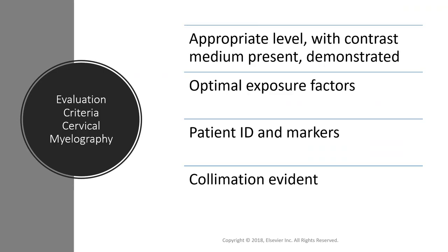Evaluation criteria for the cervical myelogram: the appropriate level with contrast medium present and demonstrated, optimal exposure factors, the patient ID and markers, and collimation should be evident.